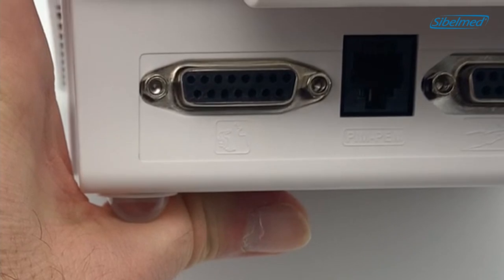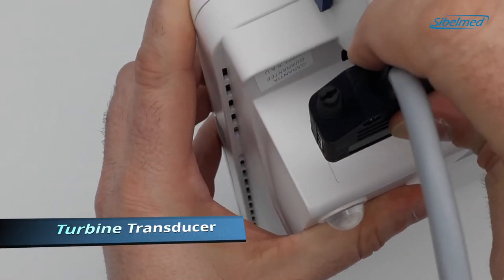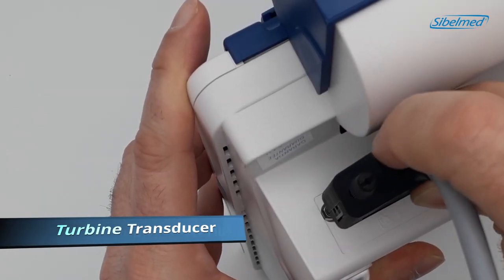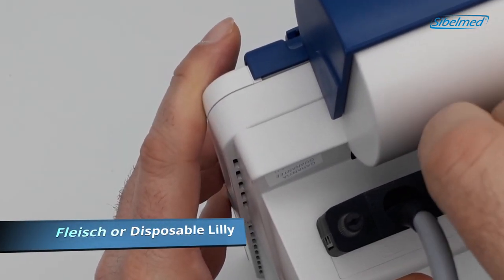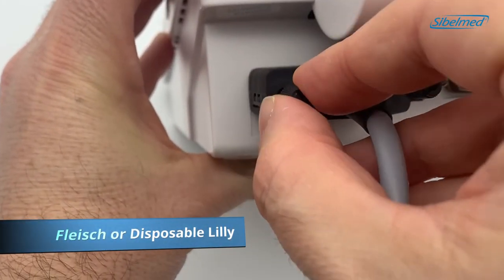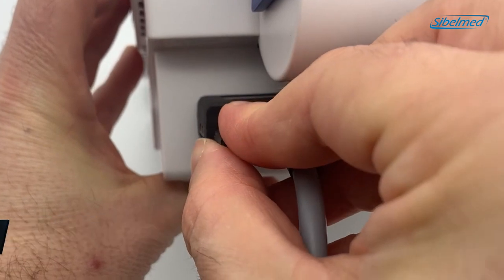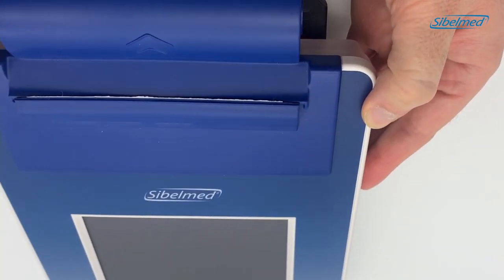In this video we are using a turbine transducer. Position the connector and twist the two screws to lock it. This device also allows measurement by a pressure pneumotachometer or a single-use lily transducer. Please connect the USB cable on the back panel — this will link it to the PC software.